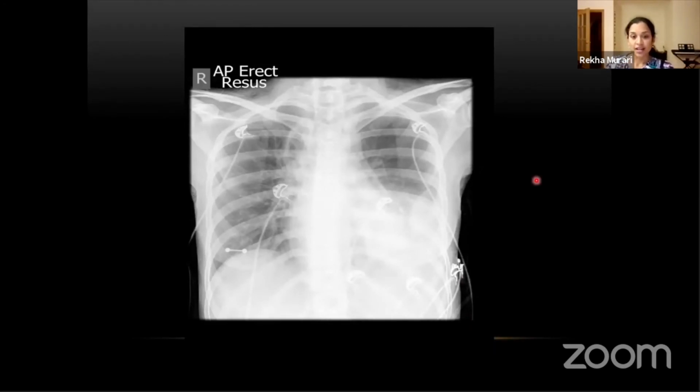I just put this chest x-ray to show you guys that not everything is just one pathology, straightforward and crystal clear. Some chest x-rays are so complicated. It can be very, very tough sometimes. Especially when the patient is in ITU, there's an AP projection, supine, and the patient is rotated. There's so many things you need to look at, the tubes and the positions, and the ECG wires. And then you can see there is this line here.